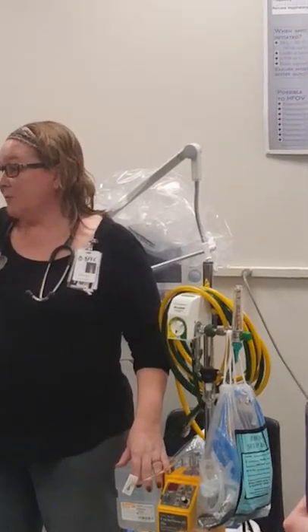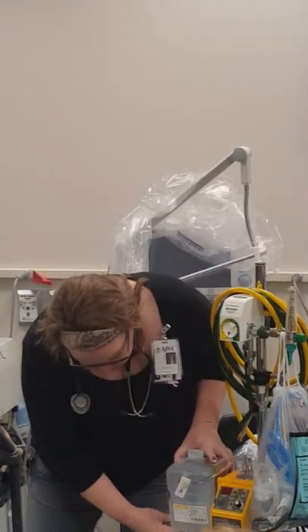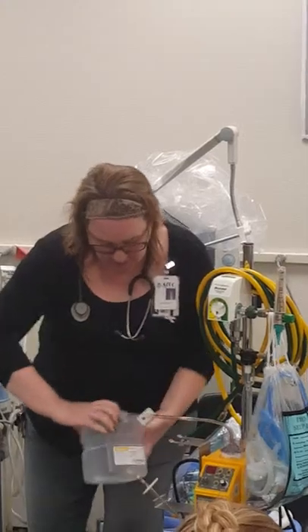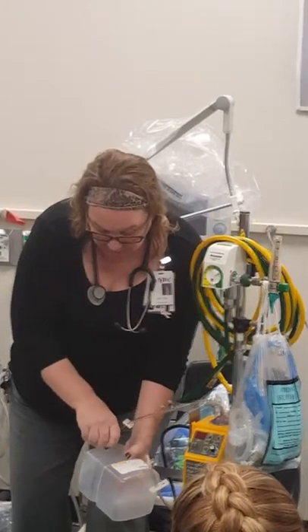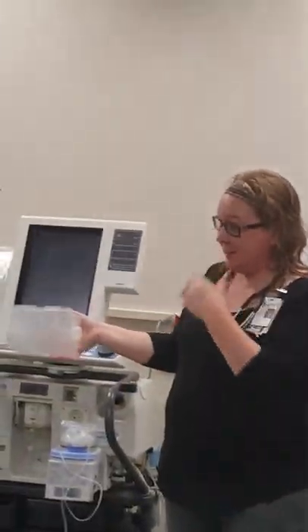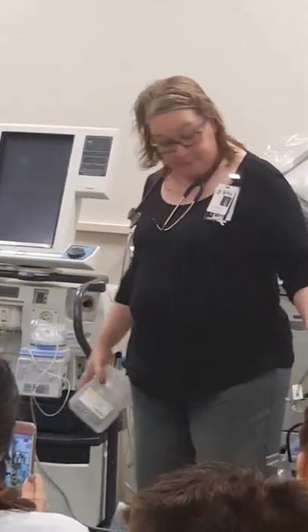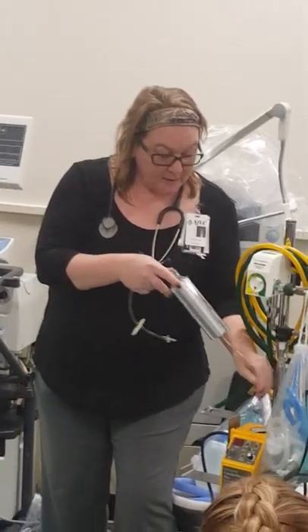This is called a concha system, so if your preceptor ever tells you they need a concha, this is what they're talking about — they need the water bottle replaced. As you can see, this one's empty. You take it out just like that, turn it like this, clamp the lines off and pull them out, throw the old one away, get a new one, put it back in, poke it with the connectors, unclamp it, and it will automatically feed water down, just like the cylinder I showed you.